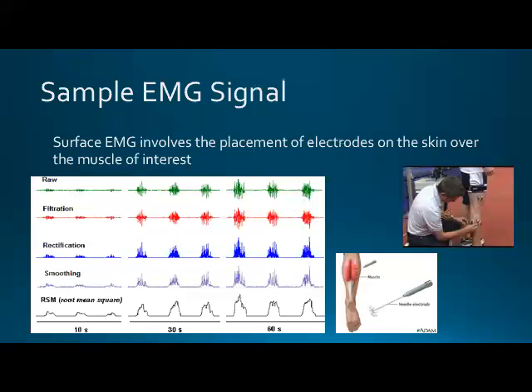It's going to allow you to look at much smaller groups of muscle fibers, whereas what we're looking at with that raw signal, that's hundreds of activated muscle fibers, right? Hundreds. Because it's whatever muscle fibers fall underneath where we've placed our sensor. So it's really hard to say the specific activities of just one type of motor unit or a very specific subset of motor units. You can even pick up activity from other muscles, right? So the recommendations are to pinpoint or try to isolate muscles that you're particularly interested in.